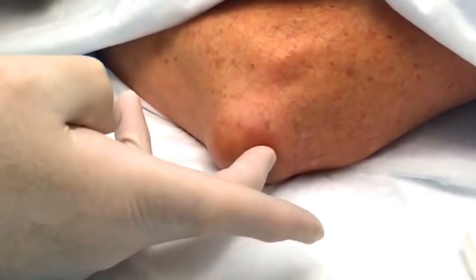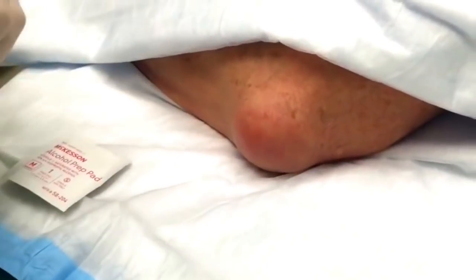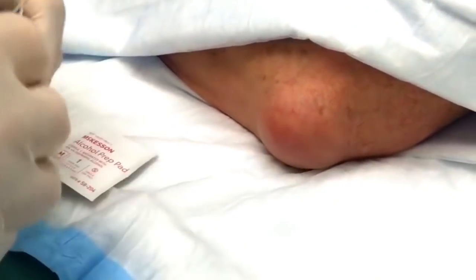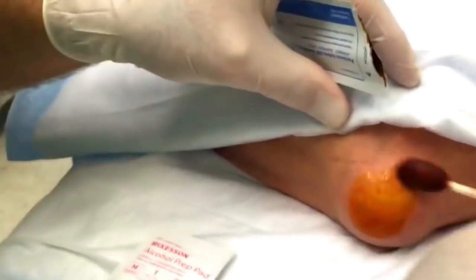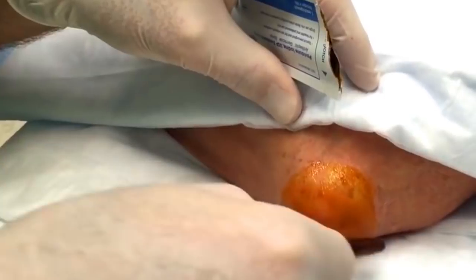This swollen elbow joint, you can see I'm going to push here. Does that hurt, by the way? No. It's not a painful problem. So this just showed up a couple of days ago, right? Yes. And you didn't fall and bump your elbow? Nothing like that happened. Good. Okay, so what we're just going to do is use a little betadine. We're going to clean this up, and we don't want to get an infection.